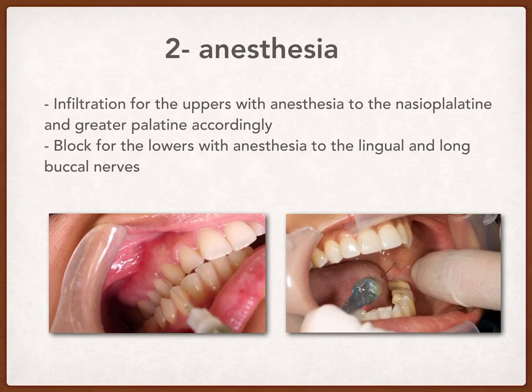Also, we should anesthetize the nasopalatine and greater palatine nerves according to the teeth that are present, and that is by infiltrating the area between the mid-palatine suture and the intended tooth, the middle part of this area.